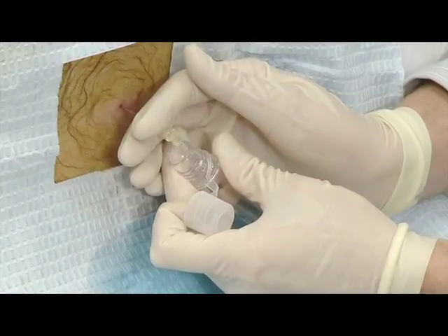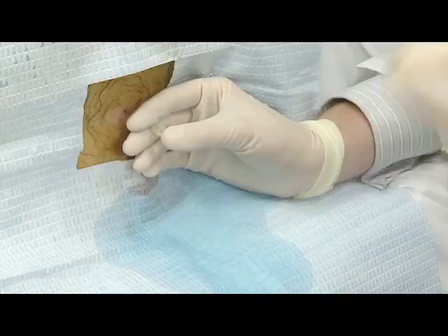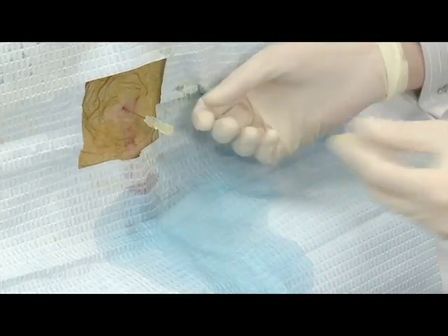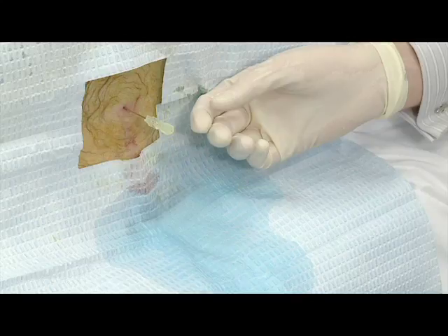This usually occurs slowly, drip by drip, but if flow appears too slow, replace the stylet and rotate the needle up to 90 degrees to potentially release a nerve root that is pressed up against the needle tip. Remember to rotate the needle back to its original orientation before removing it.